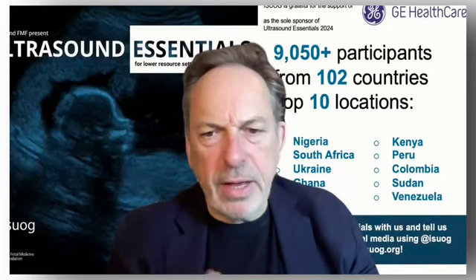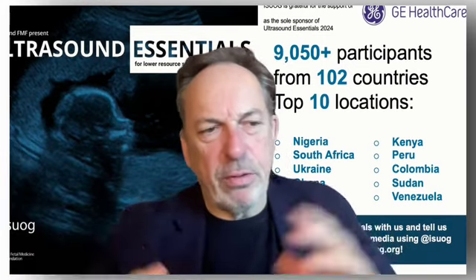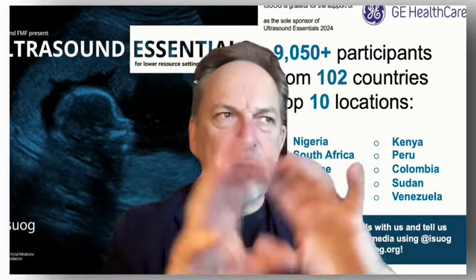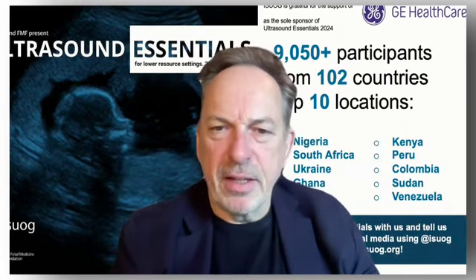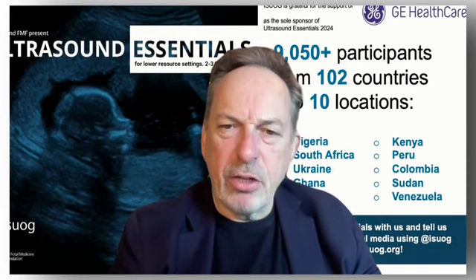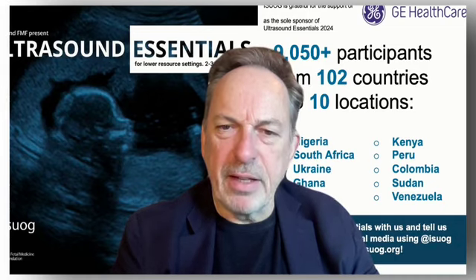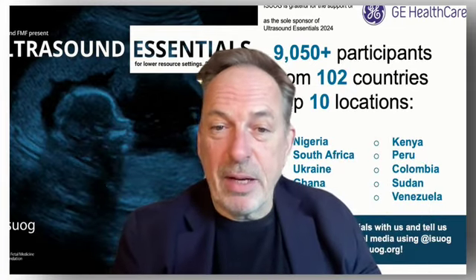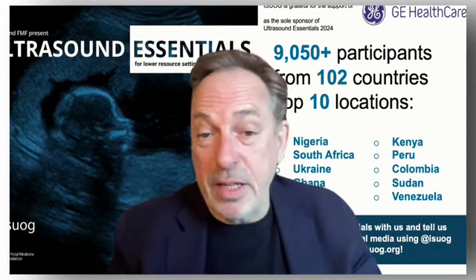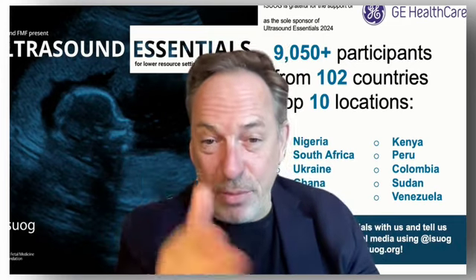Just finally, you ran through what I would call more straightforward stuff, and then the anatomy around the parametrium. You demonstrated it so nicely. How long did that take you to master, or is that something you got to grips with quite quickly? Because I think some people find it quite difficult, the idea that you can see all these structures. But it's interesting: years ago, I never looked at ureters. When I started scanning, it wasn't something I did. But then it's actually quite easy, isn't it? You just literally move the probe. Yeah, exactly.